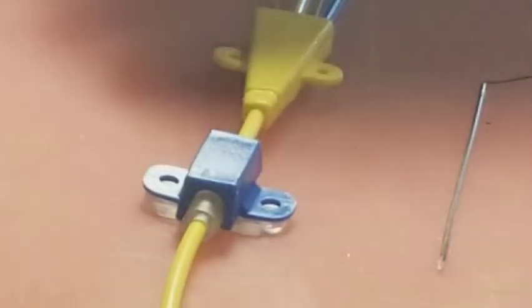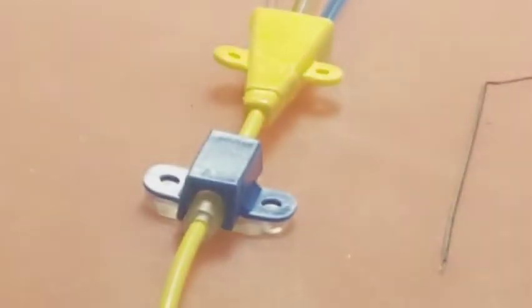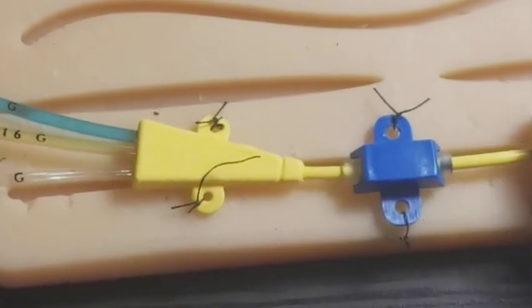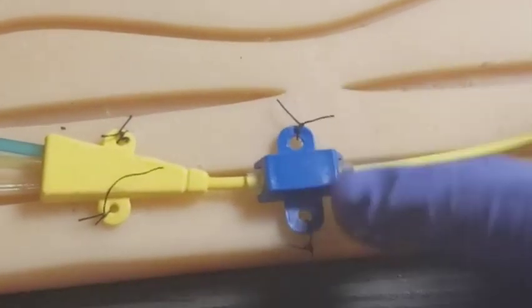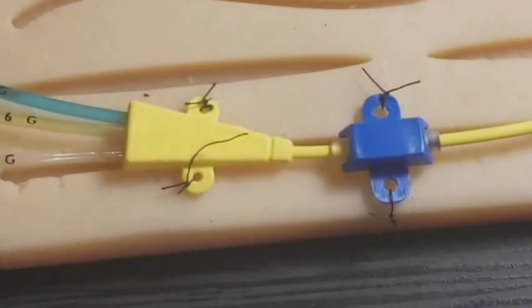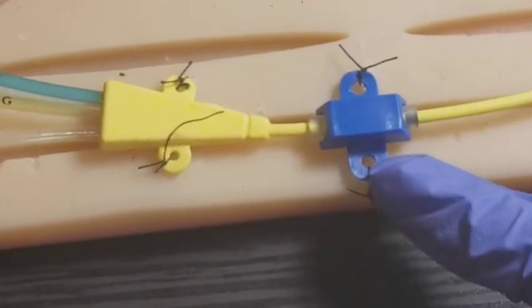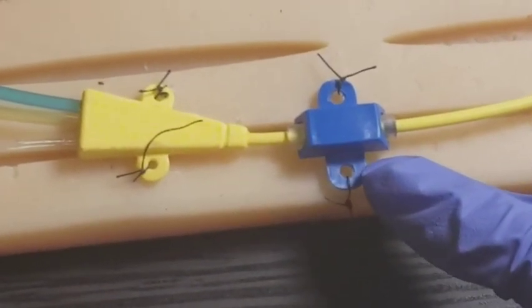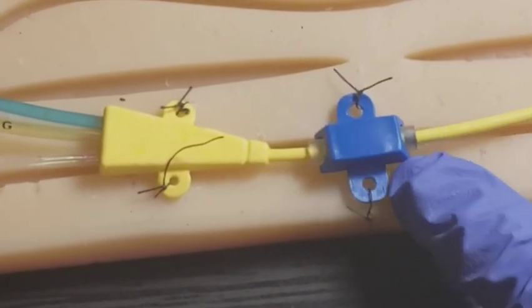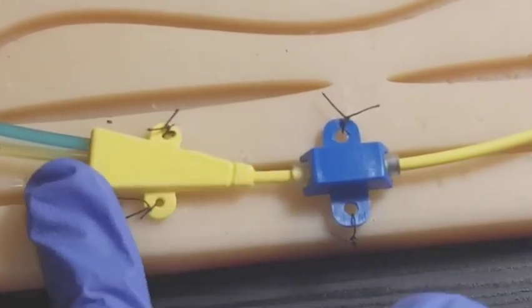Now you can see the 4 points of suturing clearly. 1, 2, 3, 4. Then this ensures that the central line stays in place, and I've secured the line in 4 places. 1, 2, 3, 4. I used a simple interrupted suture and tied it with a one-handed tie. This blue cap is sitting on top of a clear white cap that comes from the central line kit. That is sitting on top of a double black line, which represents 20 centimeters. This is proximal to the patient's head, and this is the distal portion.